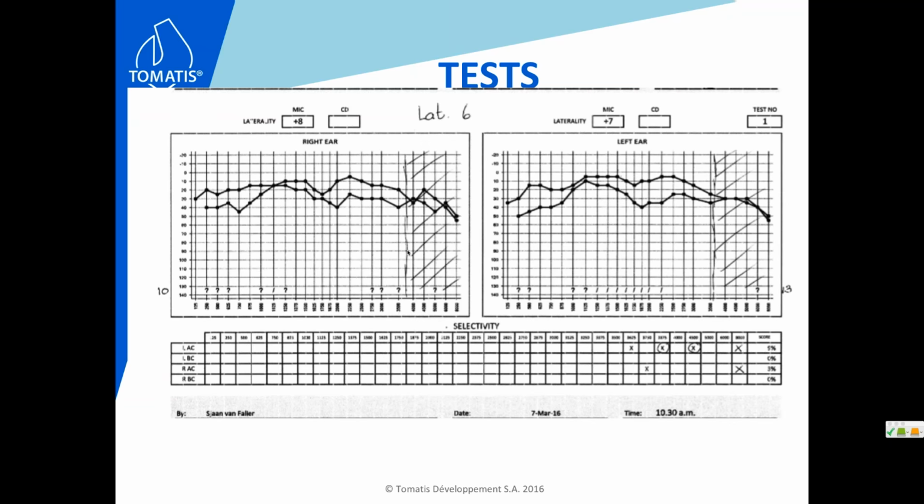And also the selectivity, which is, even for an adult, quite close, and touches also the higher frequencies. So it means that there's a protection in that area also. Now you also have to take into account the difference between the left and the right ear.